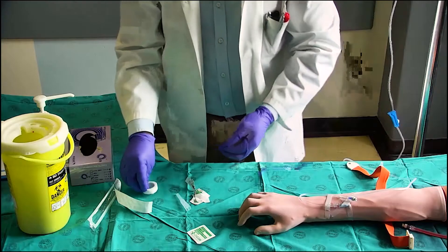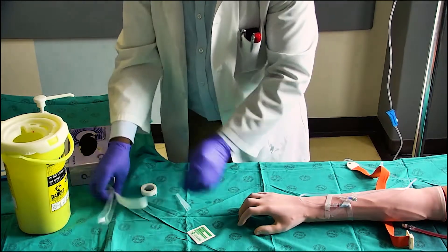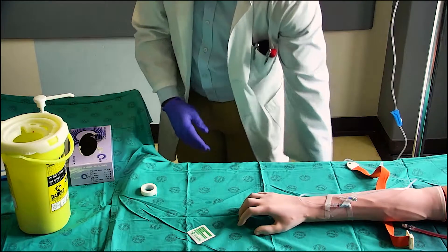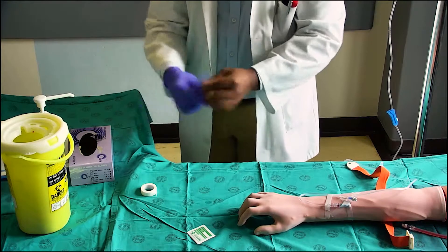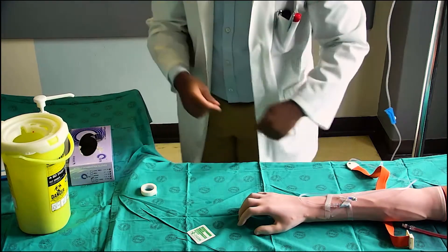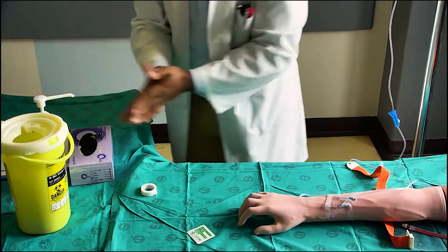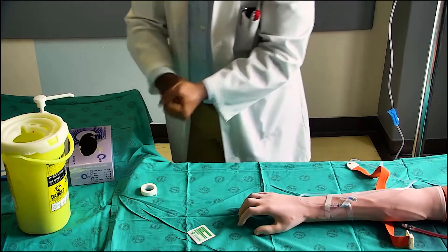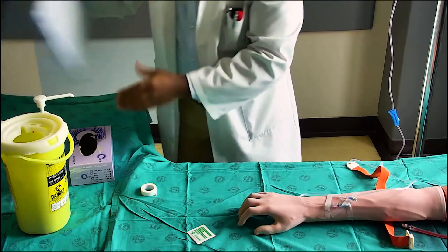Thank the patient and ensure that the patient is comfortable. Discard all used medical waste into the red bin. Discard all general waste into the clear transparent bin. Remove gloves and disinfect hands with disinfectant. Ensure that you document the procedure.